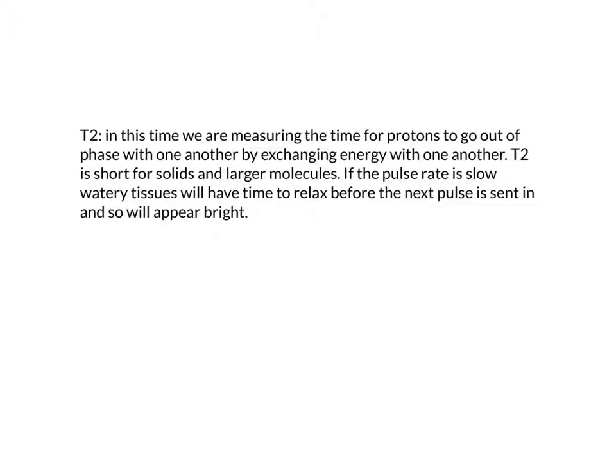T2 times, we're measuring the time for protons to go out of phase with one another, so that the energy is spread to other protons. The T2 is short for solids and larger molecules such as fats, carbohydrates. And if the pulse rate is slow, watery tissues will have time to release and relax before the next pulse is sent in by the machine, so they'll appear bright. So T2 times are good for looking at watery molecules and things with a lot of water in them.